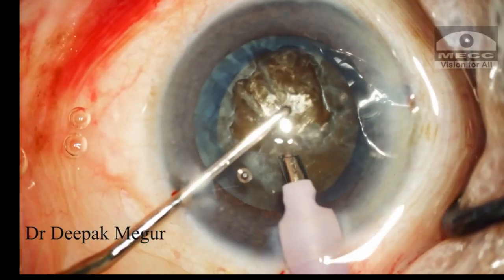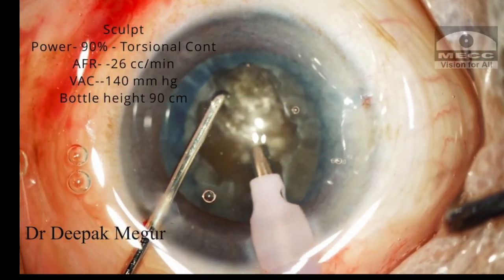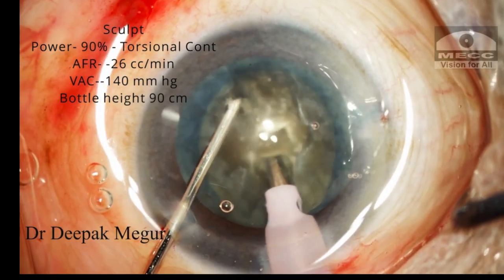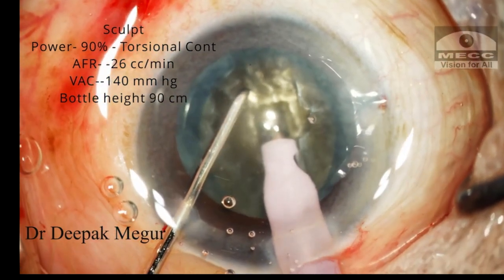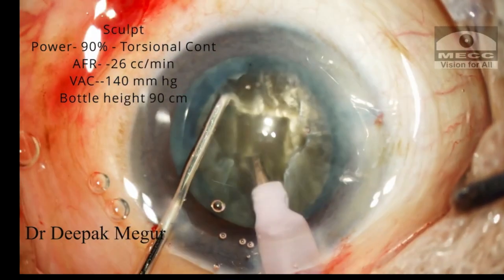Before starting, I prefer to make a small central trench so that I can bury my phaco tip in a much deeper plane and get a firmer grip. I prefer to stabilize the nucleus with my chopper during trenching. I aim to perform a trench which is about 60% deep.